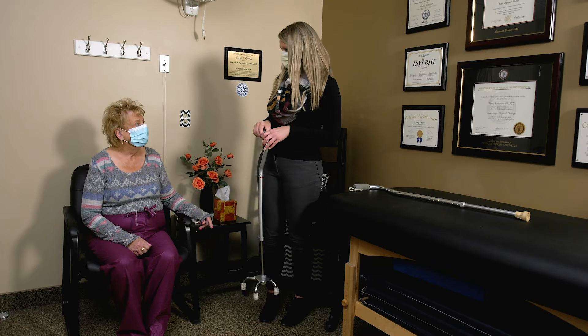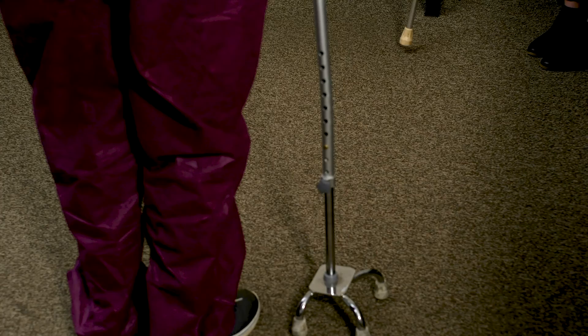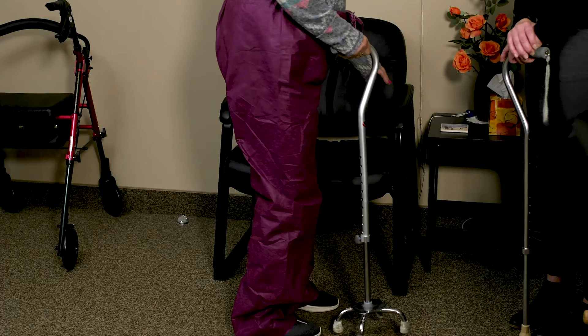We size the quad cane exactly the same as the standard cane. Go ahead and stand up and walk a couple steps forward — cane, left foot, right foot — then turn around. Make sure we do cane, left, right — good. Come all the way back to the chair, turn around, and have a seat.